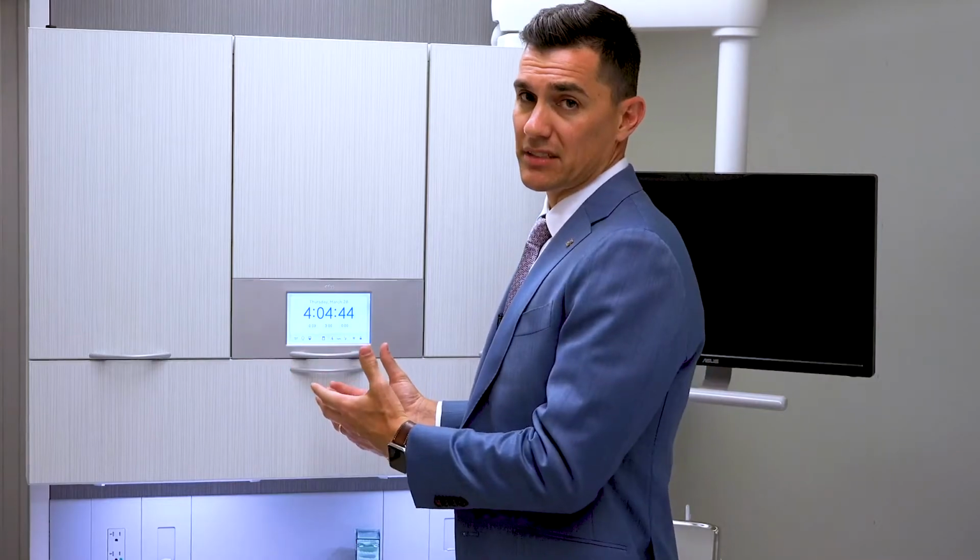So in this video, we're going to pay attention to our control center that is attached to our 591 rear cabinet. The control center itself gives us the ability to control most of the functions of the operatory through one touchpad and one screen that we can touch to control our chair, our lighting, timers, things like that we're going to need while we're in the operatory treating a patient.